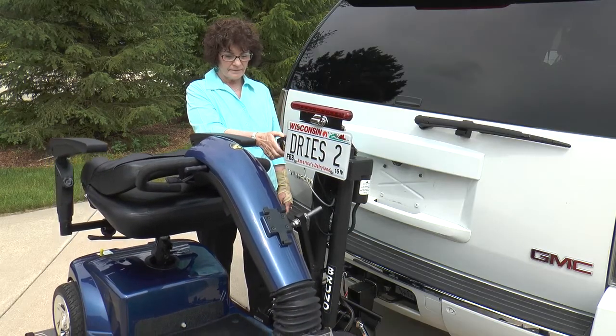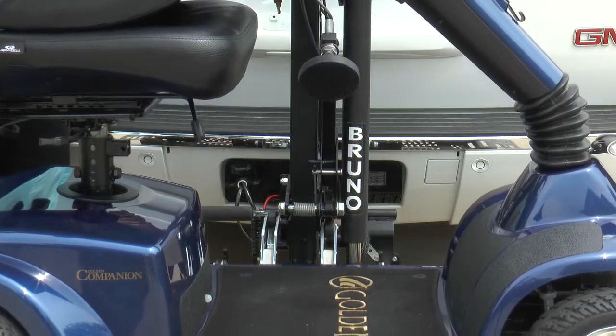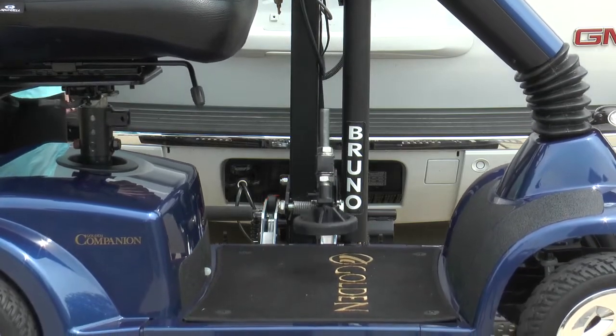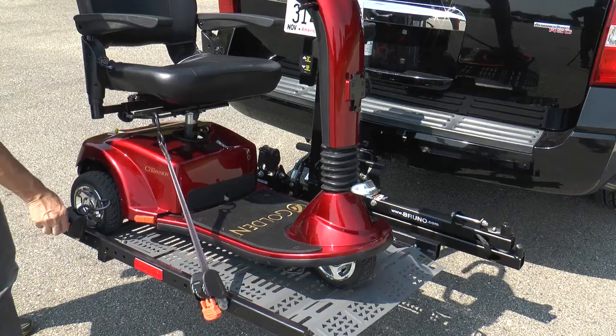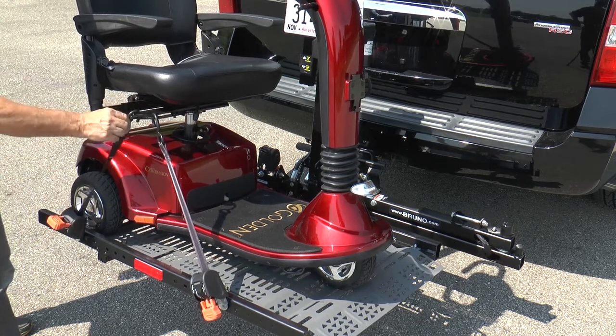Securing the mobility device for travel is simple on all Outsider models, ranging from a fully automatic foot, to a locking swing arm, to three retractable belts with one-hand operation.